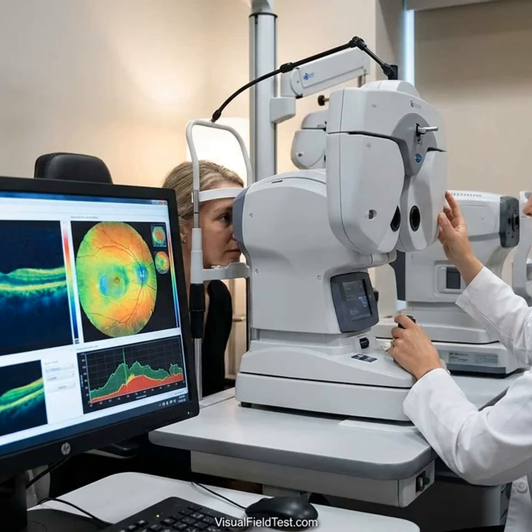Is there a trend? If it looks like the OCT numbers are getting lower, ask if this is significant progression and whether treatment should be adjusted. If they show you past scans, ask how fast the thinning is per year.